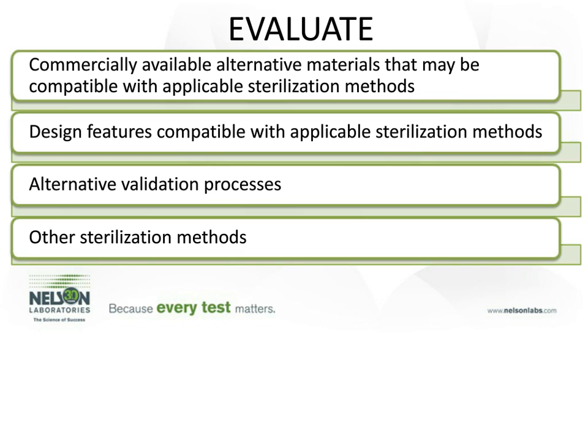What is meant by that is that a lot of work has been done on materials that already exist, and it's known how they react to your common sterilization modalities such as radiation or ethylene oxide, steam, dry heat, those types of things. So there is quite an assortment of information out there that can be used when you are starting to look at how a material might be used appropriately in a new medical device.